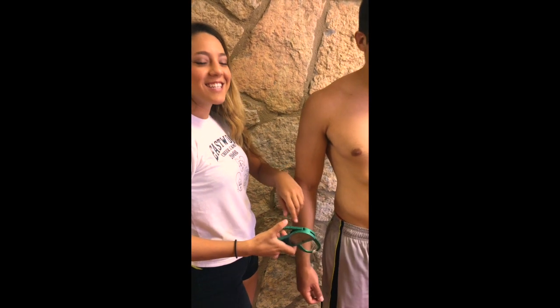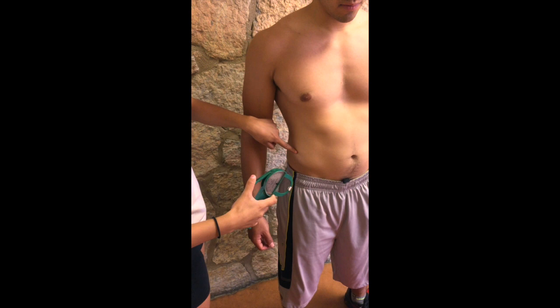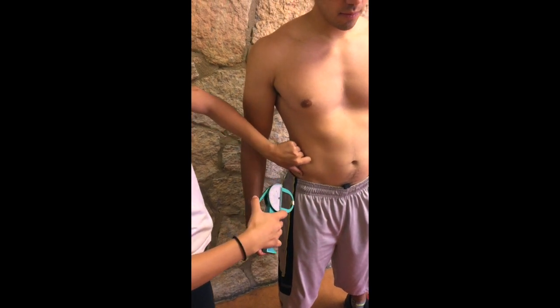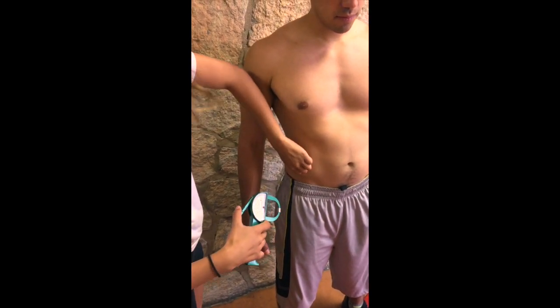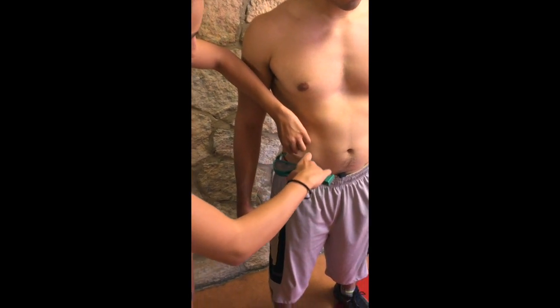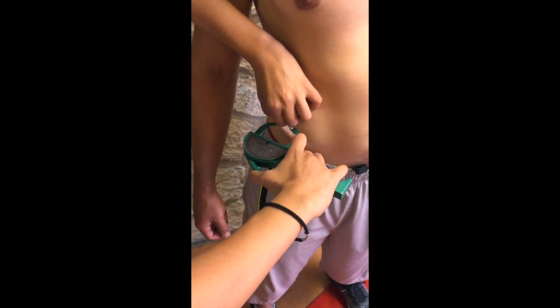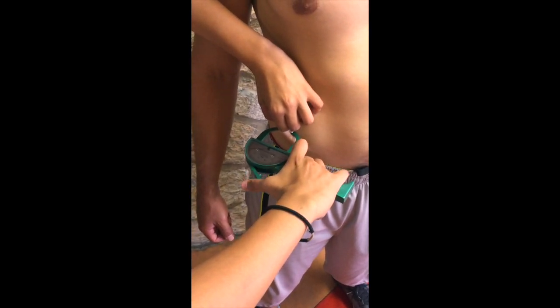When taking skin fold measurements, the caliper should be placed on the skin surface about 1 centimeter away from the thumb and the index finger, perpendicular to the skin fold. It is important to keep pinching while taking the reading. You should wait 2 seconds before taking the reading, then release.